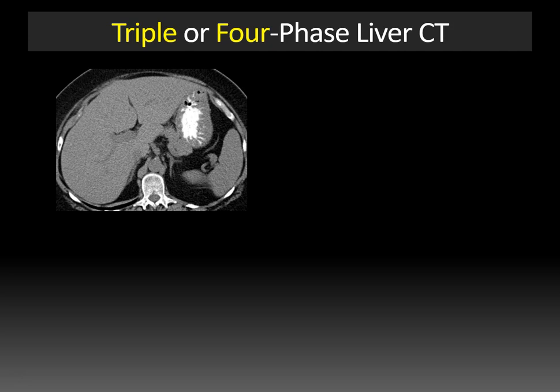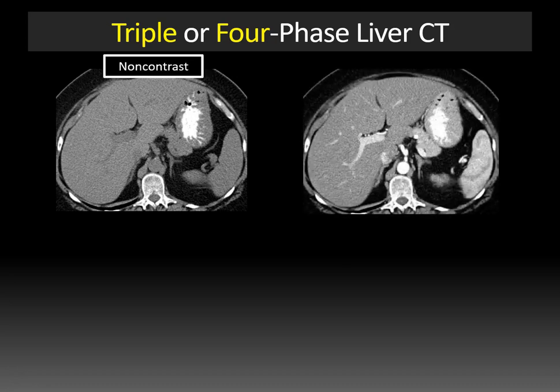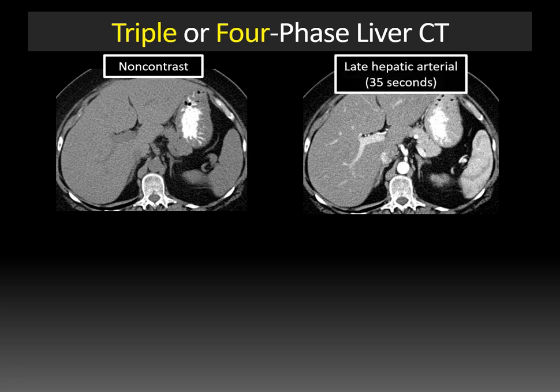A typical multi-phase liver CT protocol usually has three or four phases. Starting with the non-contrast phase, you can see that there's no contrast within the aorta. After contrast is given, the first phase we should see is the late hepatic arterial phase, which occurs about 35 seconds after the time of contrast injection.